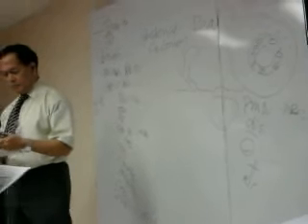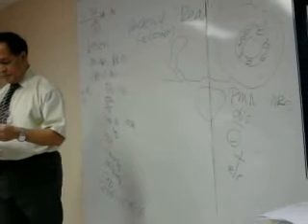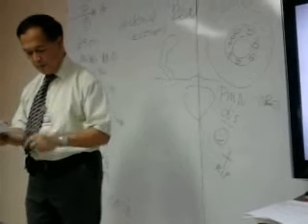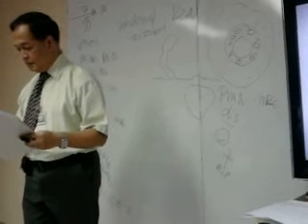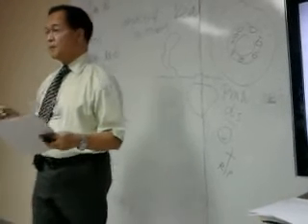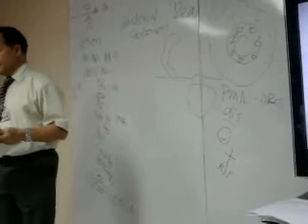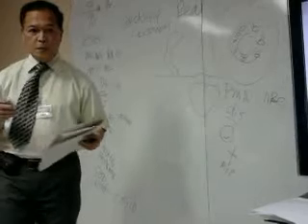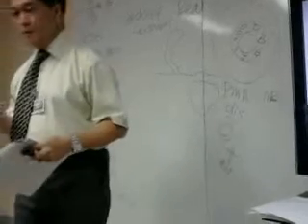Stage 4, a small nodule in the forearm of a 15-year-old student. Grossly, the specimen consists of a 3 by 2 centimeter skin fillet with a slightly raised gray-brown lesion in the center. Microscopic sections show dense fibrocollagen, highly eosinophilic hyalinized tissues in the dermis.